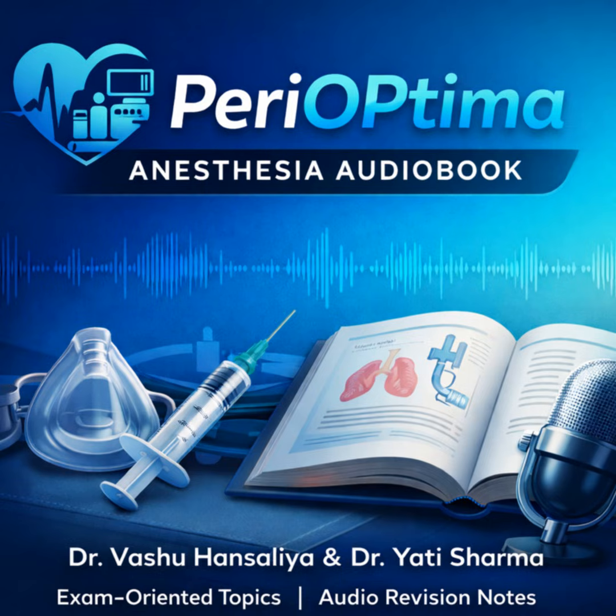So if we were to summarize the pros and cons of DL before we get into complications. Well, the advantages are clear. It's familiar, it's universally available, it's cheap, and it's reliable in routine airways. The Macintosh, in particular, with that wide flange, gives you a lot of room to pass the tube. And it's generally safer for teeth. The curved blades are generally considered less likely to cause dental damage.